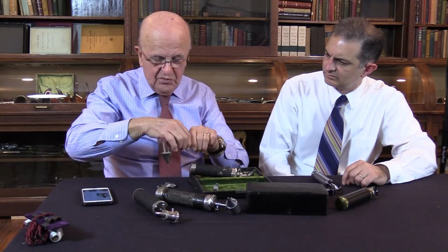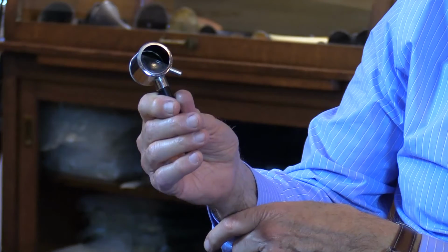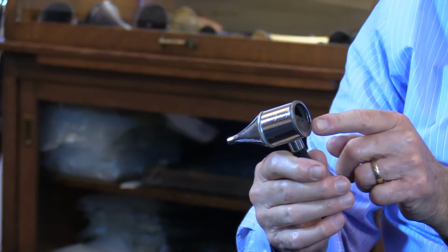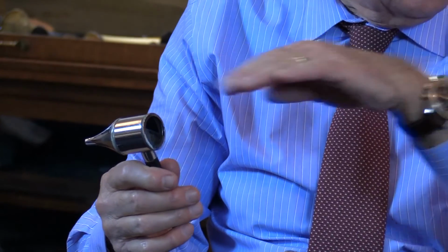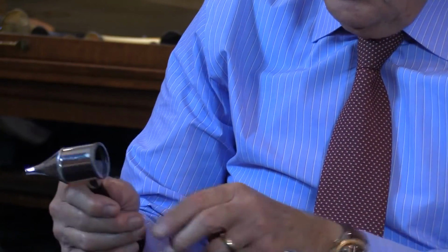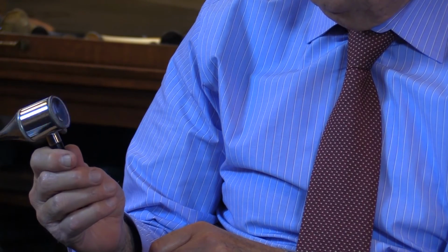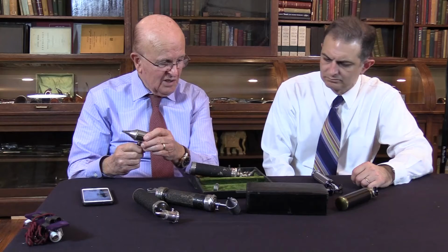And some of the otoscopes were more generous with the opening. As you can see here, half of the lens is gone, and there's the other half for magnification. Doesn't that remind you of the early ear speculum that was shaved? Half of it was removed. They had this half lens. And again, you can take this out and put in your magnifying glass if you don't need to do any operative maneuver inside the ear canal.